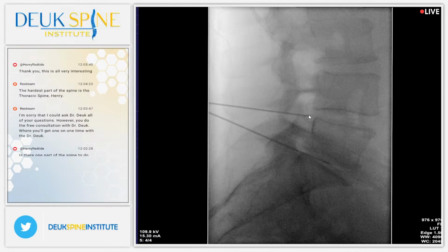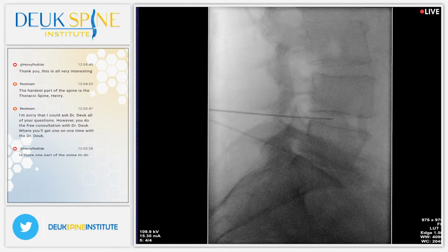That herniation is a result of a tear in the back of her disc. That tear allowed pieces of nucleus to come out and get stuck in the tear as well as cause a herniation. That's where her back pain's coming from primarily. The second source of back pain is her piriformis muscle. So we're going to fix the discs first, which are causing back pain, and then we're going to fix her piriformis muscle.